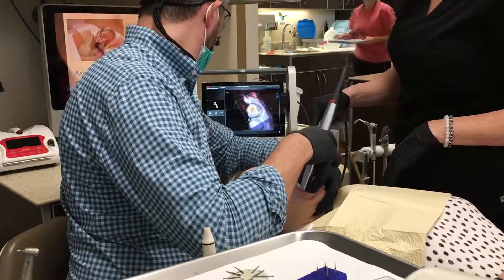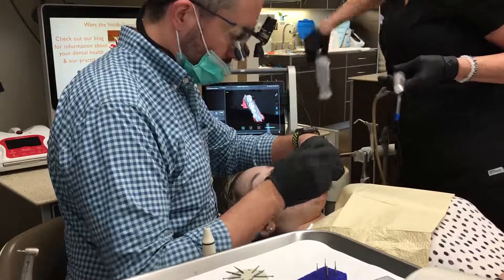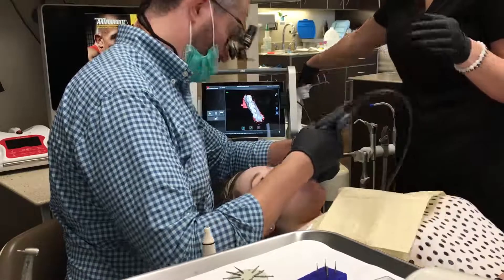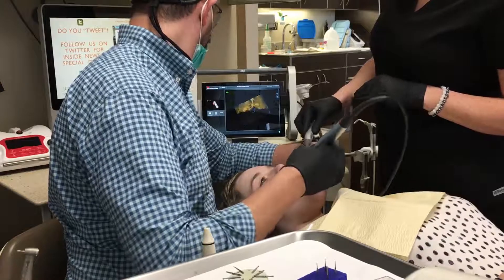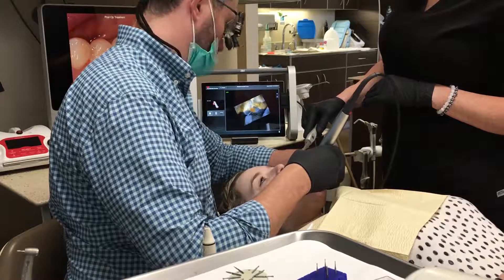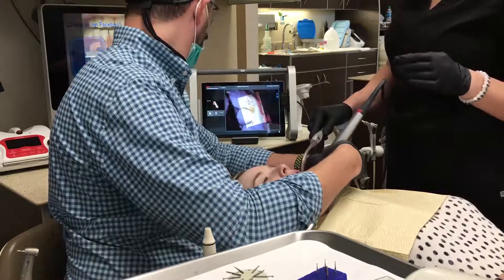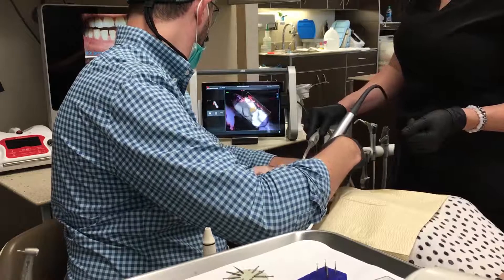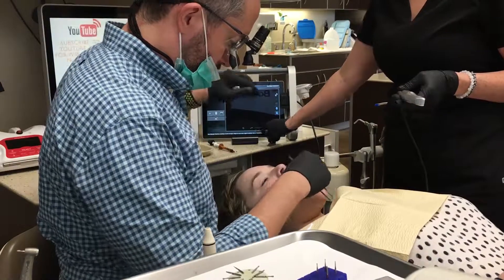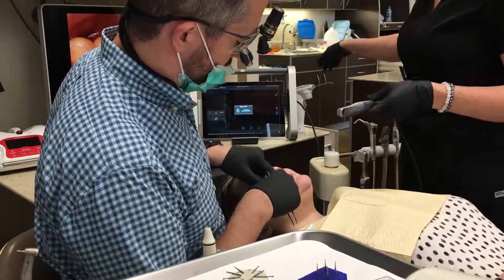On the lower, we want to make sure we get the buccal of that canine so that the lab tech can really get a good idea of that incisal guidance. In this situation, a little bit of the contrast media rubbed off on the cheek on the canine, which is where that's generally going to happen. Just add a little more — it takes literally a second — then add to the scan and it's going to pick up where we were. Once that's done, we take out the cotton roll and we need to get a bite registration. We do that digitally without anything in between the teeth, which gives us a more accurate bite registration.